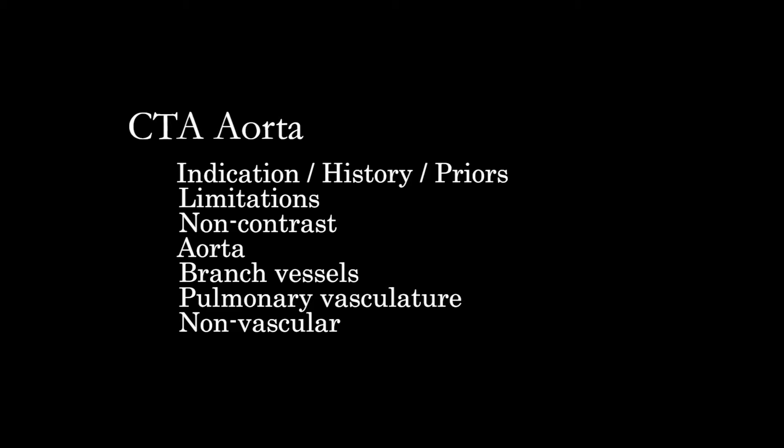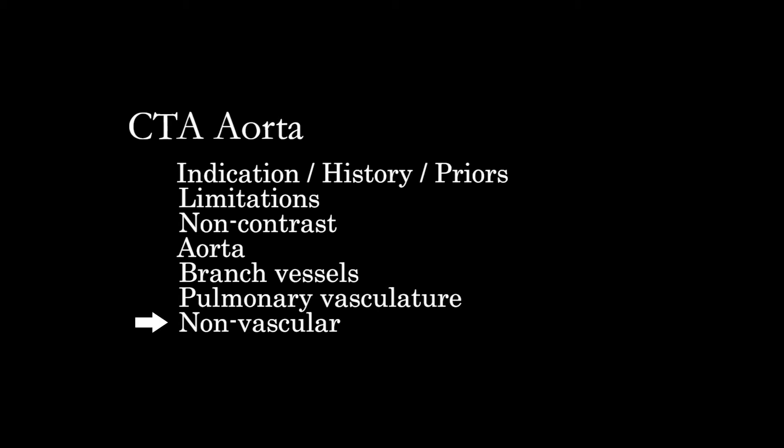The overall approach is to get a sense of what's going on with the patient, review priors, identify any limitations, look at the scout localizer, then go through the non-contrast images, and follow the aorta looking at branch vessels including coronaries, major aortic arch vessels, mesenteric, renal, and so on in the abdomen and pelvis. We'll also look at other vascular structures such as the pulmonary vasculature, then evaluate non-vascular structures in subsequent videos.